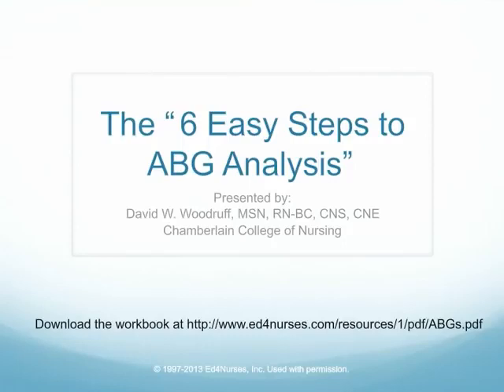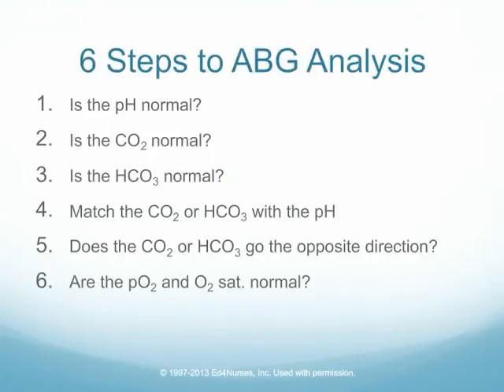In this program, we are going to go through the normal values for blood gases, abnormal values, and interpret some blood gases to give you some practice with the major components of an arterial blood gas. So let's go ahead and get started.